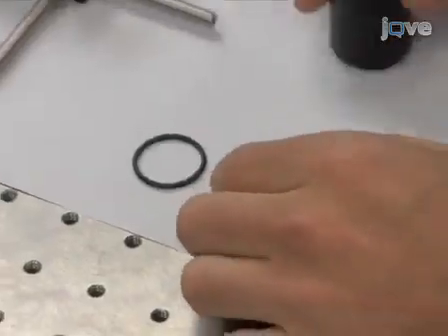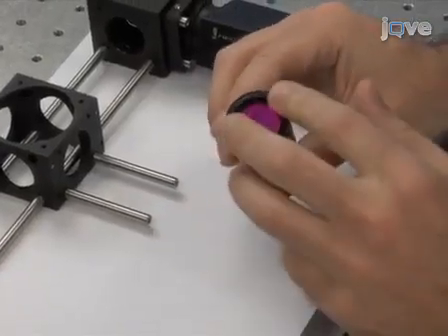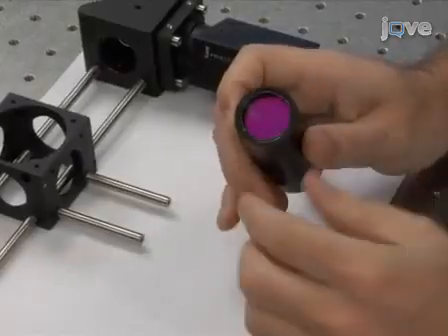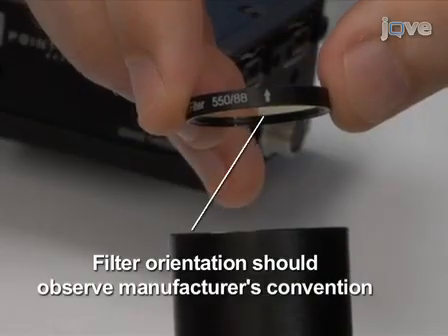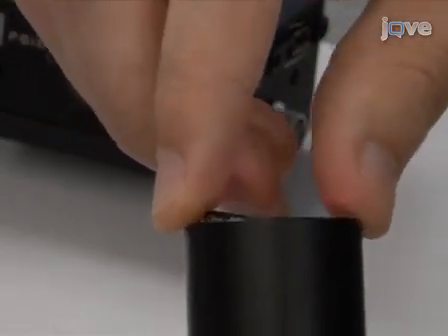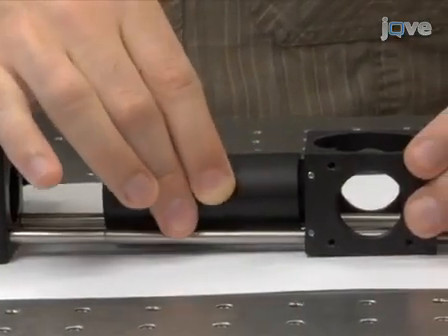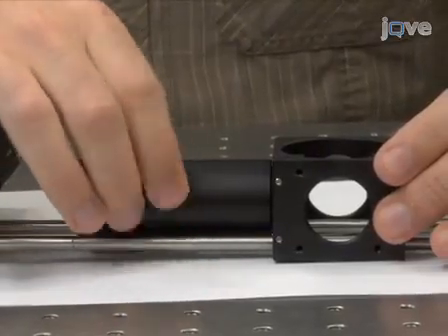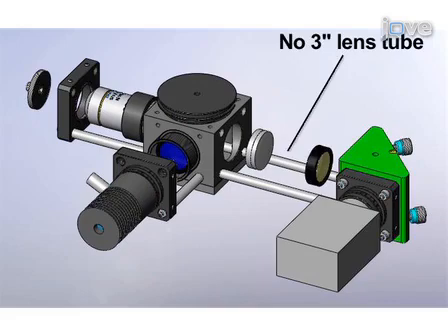Drop the emission filter into the 3-inch lens tube on top of the first retaining ring and add another ring to secure the filter in place. Ensure that the filter orientation satisfies the convention indicated by the filter manufacturer. Screw the lens tube into the side of the cage cube nearest to the CCD camera. This position is also shown here. Note that in the diagram, this lens and filter are shown without the 3-inch lens tube for clarity.